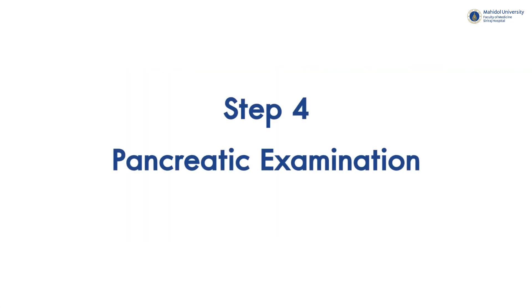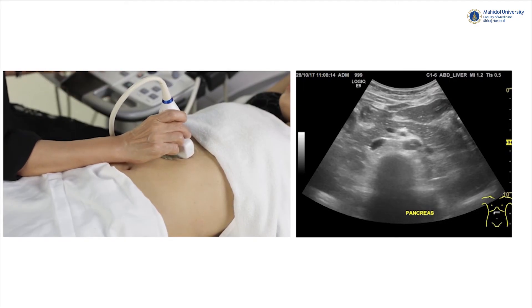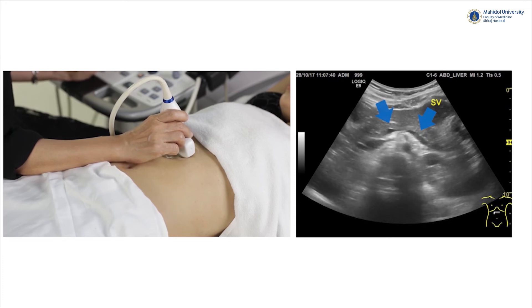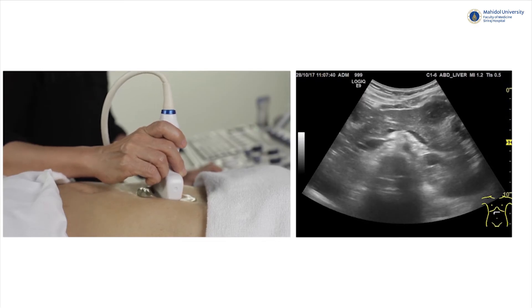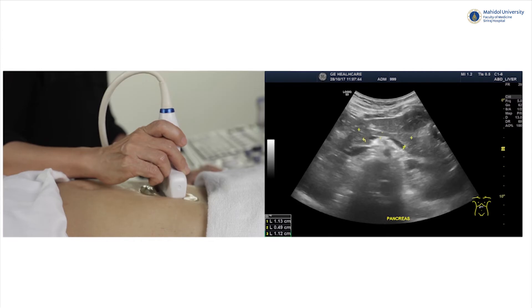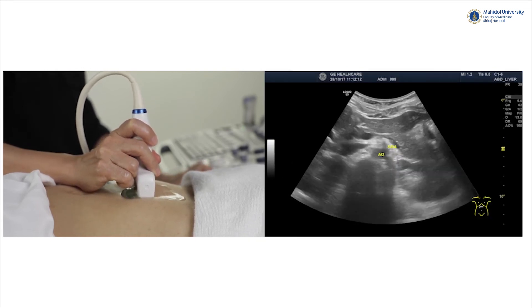Step 4: Pancreas examination. Place the patient in supine position. Gradually move the transducer in the axial plane, slowly downwards from the epigastric area, until we see the left hepatic lobe. The landmark to show the pancreas is the confluence between the splenic vein joining with the main portal vein in an inverted comma shape. Normal pancreas tends to appear as a hyperechoic organ, transversely oriented across the portal vein and splenic vein communication. Normal pancreatic widths are usually less than 2 to 3 cm. We may also see the superior mesenteric artery and superior mesenteric vein behind the pancreas.